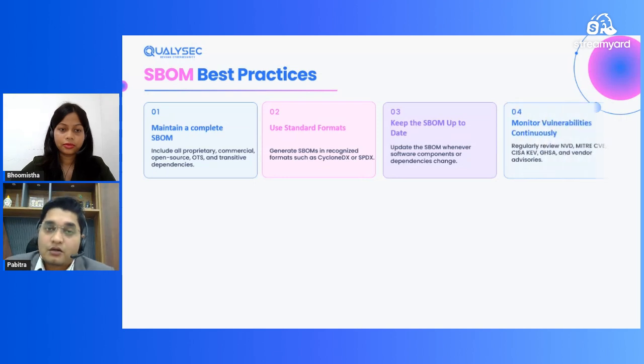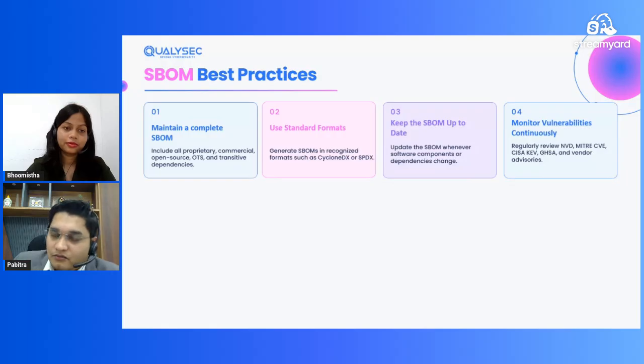Then monitor vulnerabilities continuously. It does not take you anywhere if you just list out the components and don't monitor the vulnerabilities for each. For example, for a particular component and version you are using, what vulnerability is arising this month, what new vulnerabilities are affecting our component, which directly impact our devices or our patient data. So we have to monitor this regularly, usually monthly.